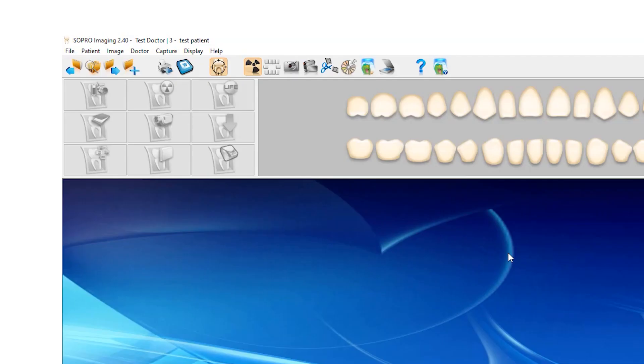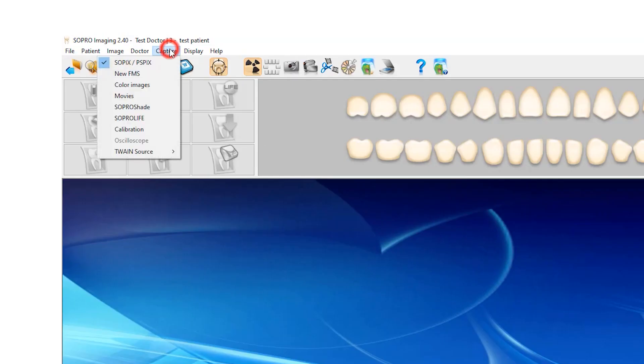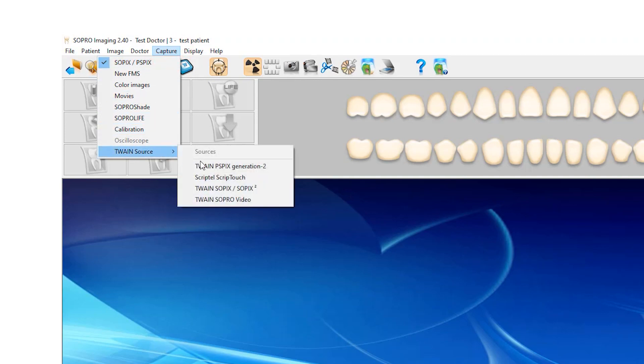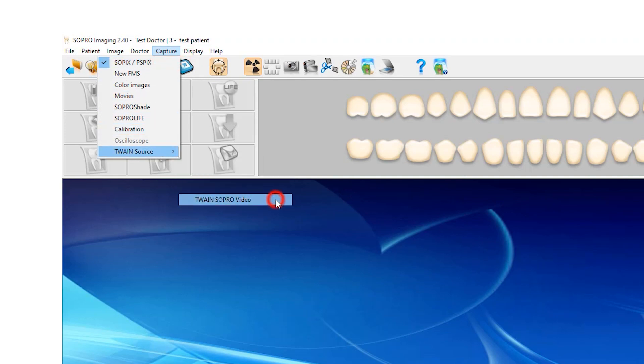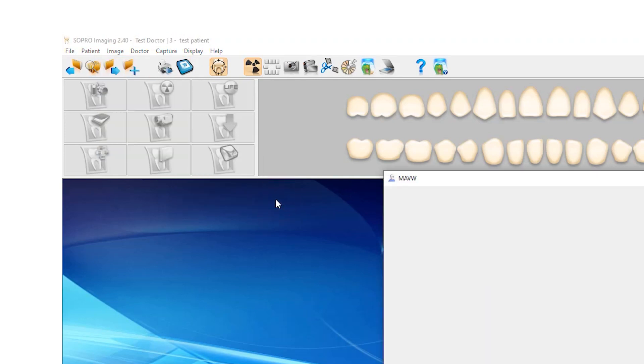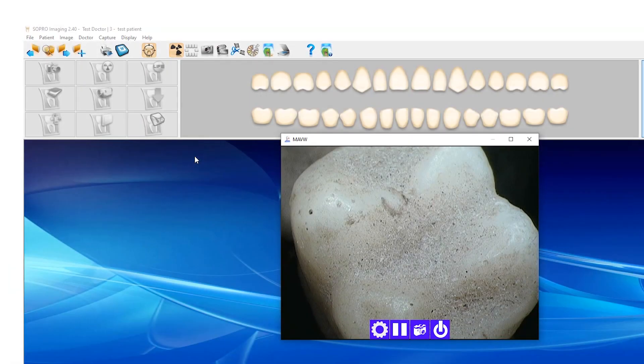To test if the camera is working, have a patient selected, then go to the Capture tab and select Twain Source, Twain SoPro Video. This will launch the capture window with a live preview of the camera's view.